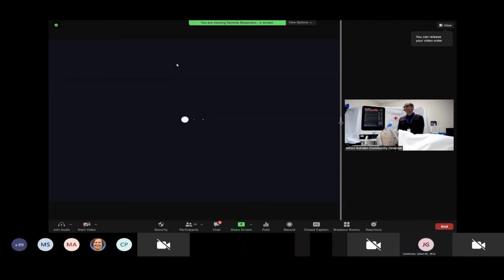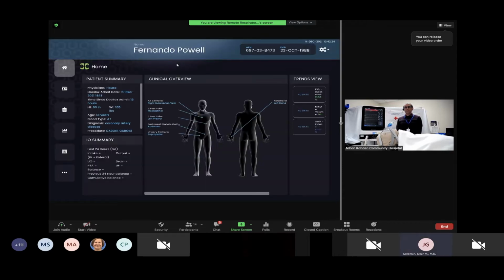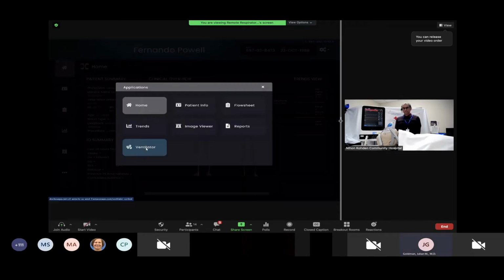Sounds good. All right, is your patient Fernando Powell? That is correct.